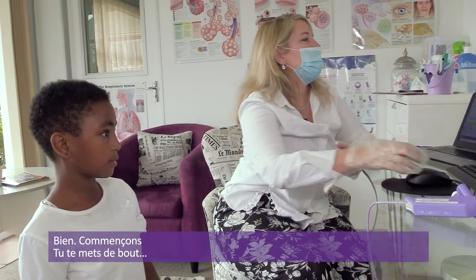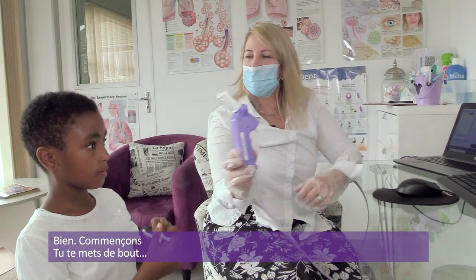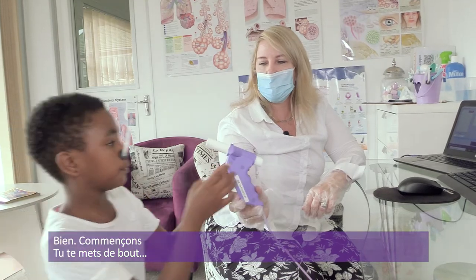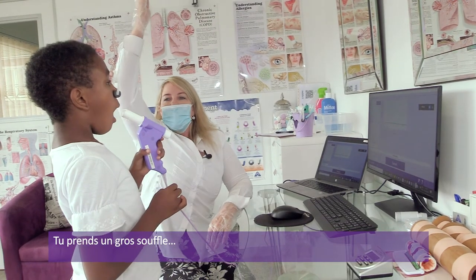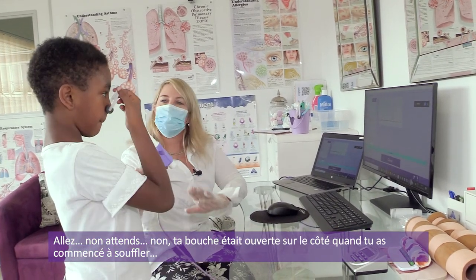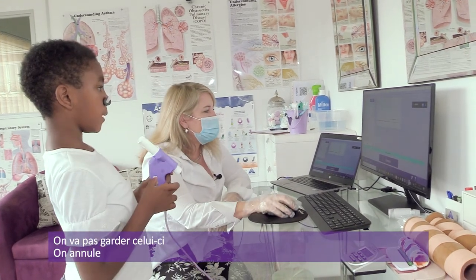Okay, good. All right, let's get started. That's it. Good. You can stand up. All right, nice big breath in. Fast as you can. Oh, wait, hold on. Okay, just wait with that one. Your mouth was open at the side when you started to blow. So let's not keep this one.